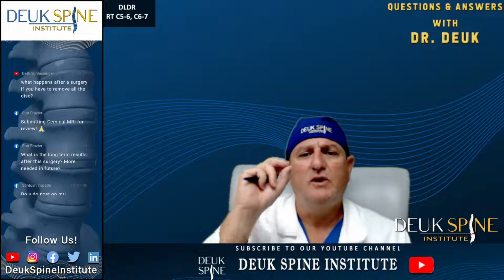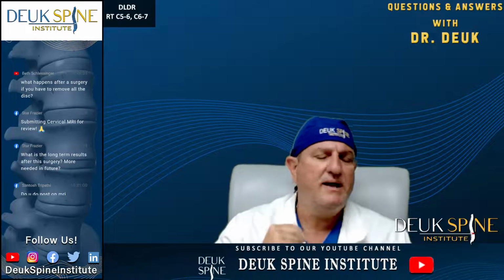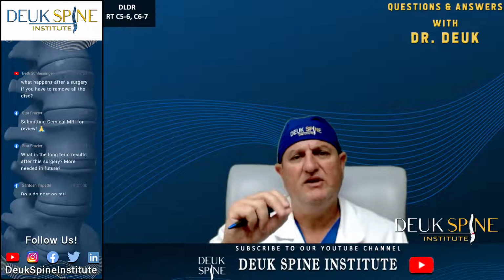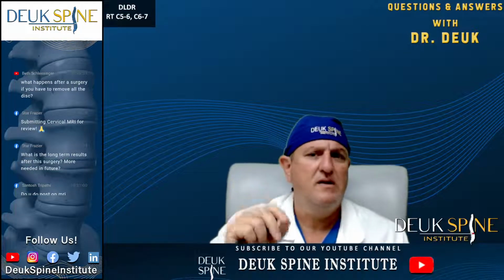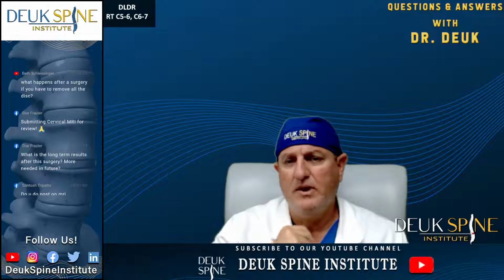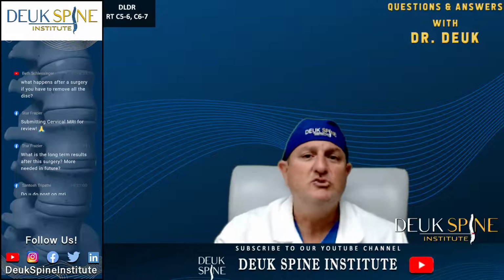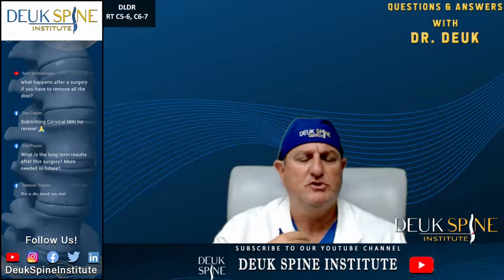Because if you look at how the Koreans, who really pioneered the anterior cervical endoscopic transdiscal approach, do it, their patients are awake, all right? And they are literally squirming around while they're going in. So that's dangerous. You could poke something you shouldn't poke.